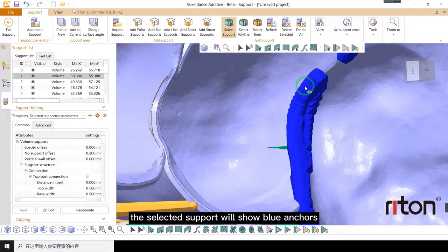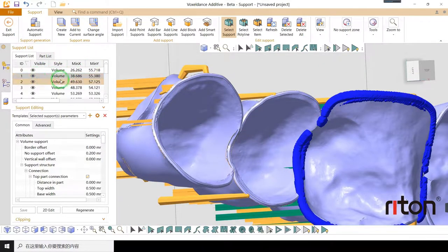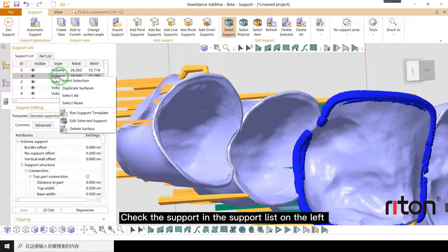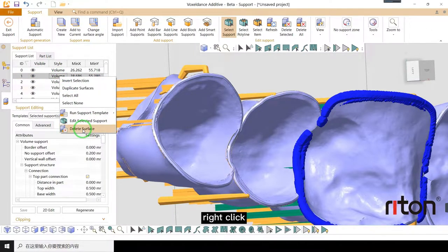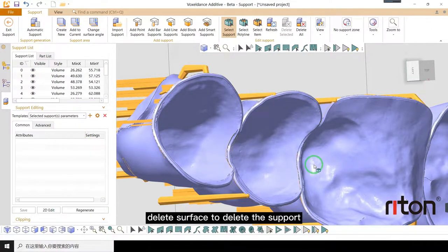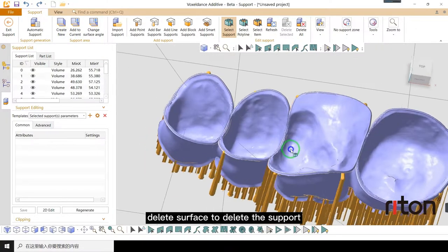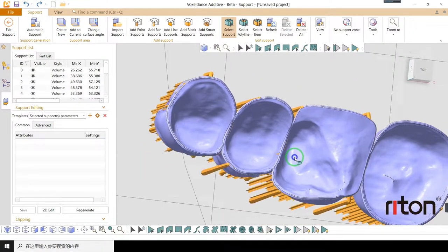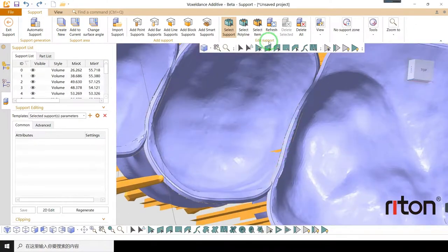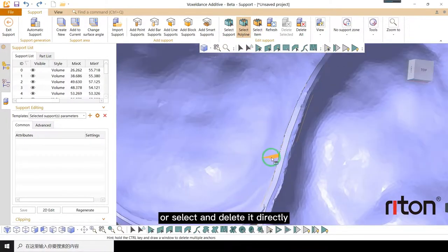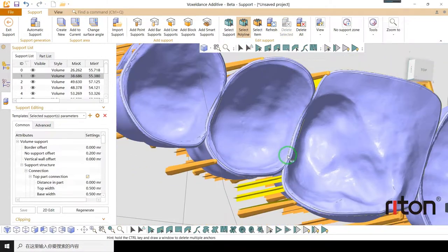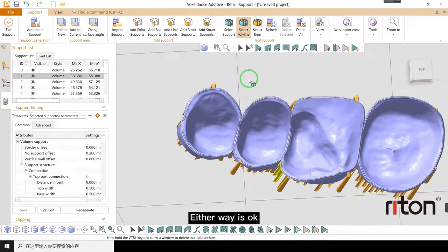The selected support will show blue anchors. Check the support in the support list on the left. Right click, delete surface to delete the support. Or select and delete it directly manually. Either way is okay.